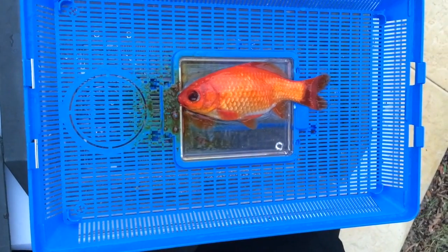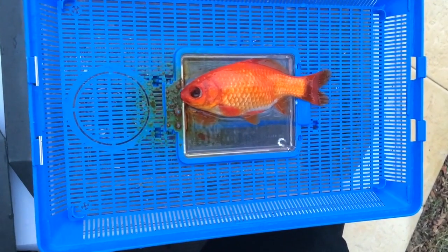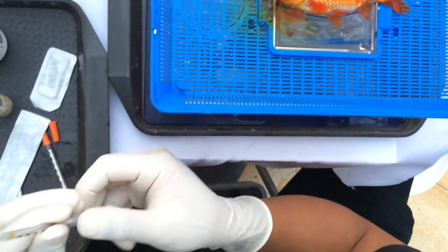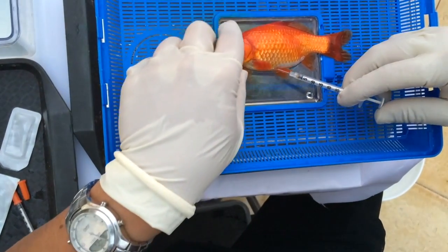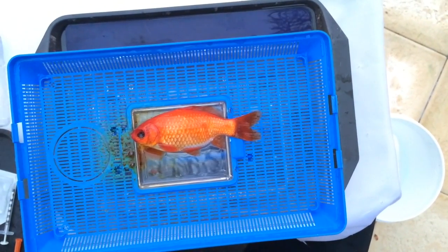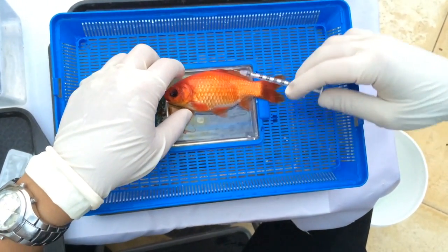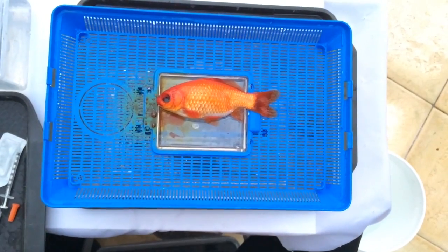So that's the surgery pretty much done. Now we give anti-inflammatories and antibiotics as a cover. We'll give that intramuscularly at the base of the fins. That was the oxytetracycline antibiotics, and then the next injection is the anti-inflammatories, given at the base of the other fin.